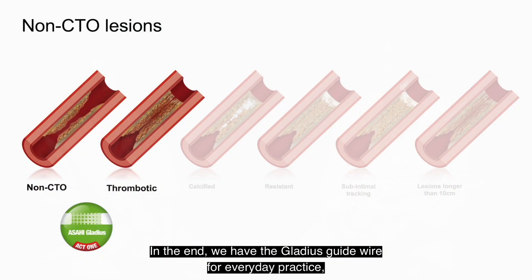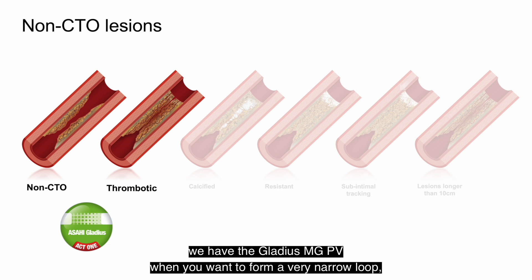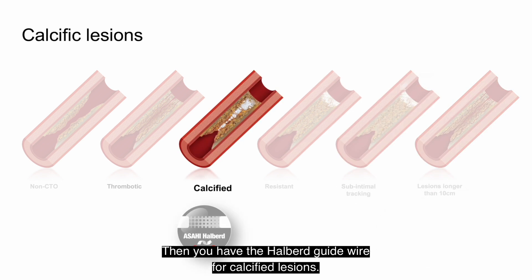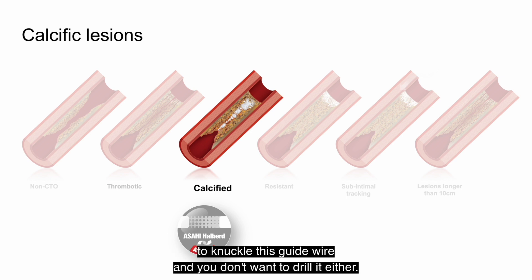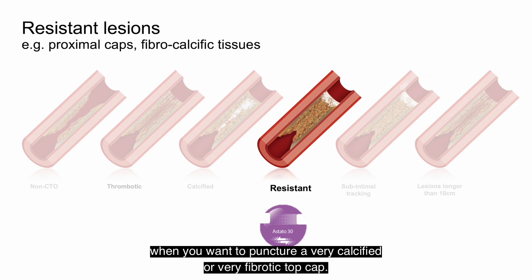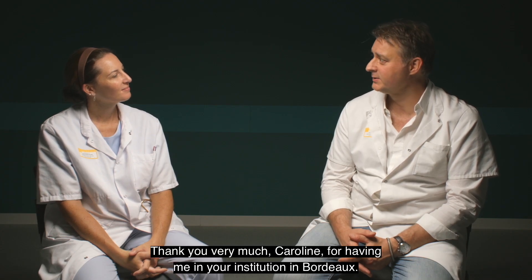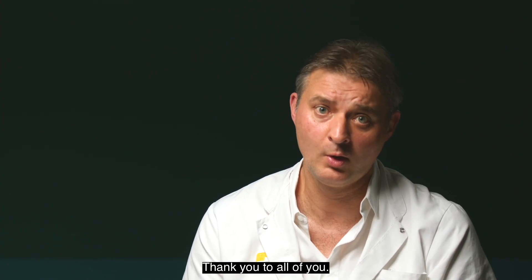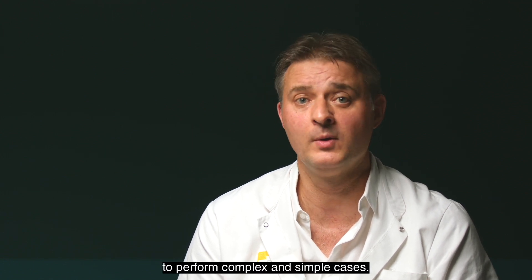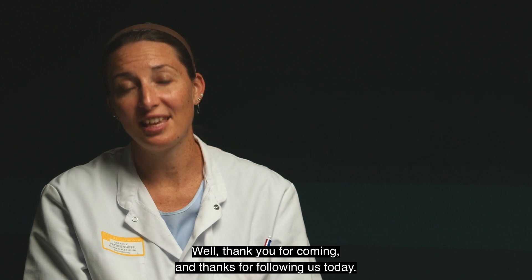In summary: we have the Gladius guide wire for everyday practice; the Gladius MGPV when you want to form a very narrow loop and navigate the sub-intimal space to cross a very difficult lesion; the Halberd guide wire for calcified lesions when you want to stay intraluminal — remembering not to knuckle or drill this wire; and finally the Astato guide wire when you need to puncture a very calcified or very fibrotic proximal cap. Thank you very much, Caroline, for having me at your institution in Bordeaux. Thank you to all of you. I hope this video will help you in your daily practice to perform complex and simple cases. Thanks for following us today.